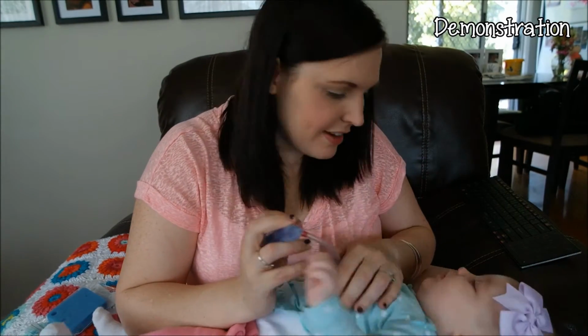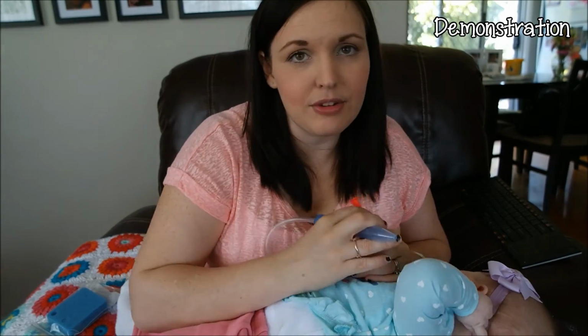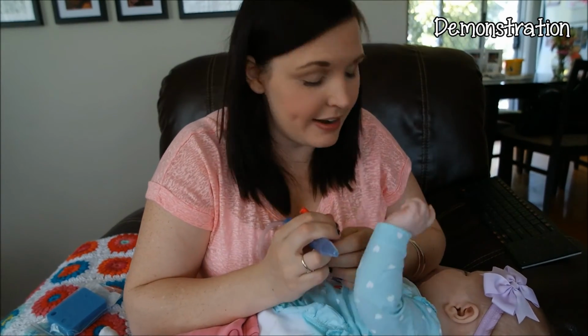And you suck. So obviously nothing has come out. And you basically just move it around a tiny bit as you suck at the same time to make sure you get everything that's coming out of the sinus area.